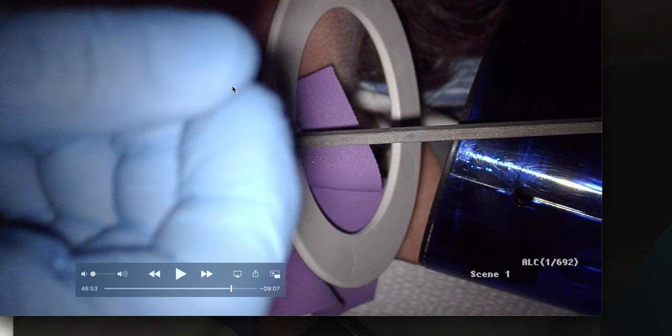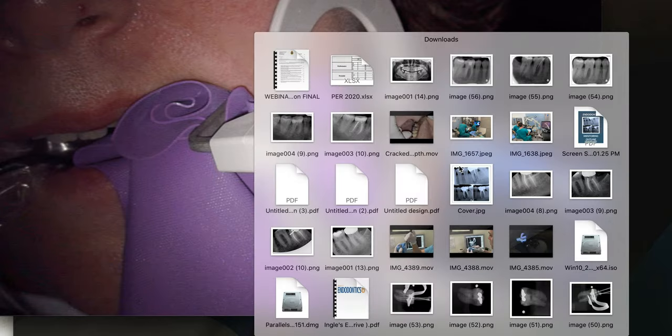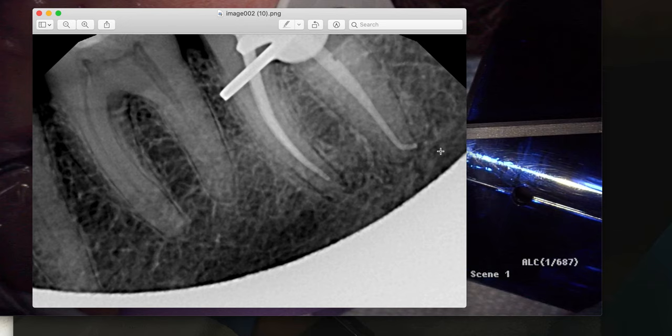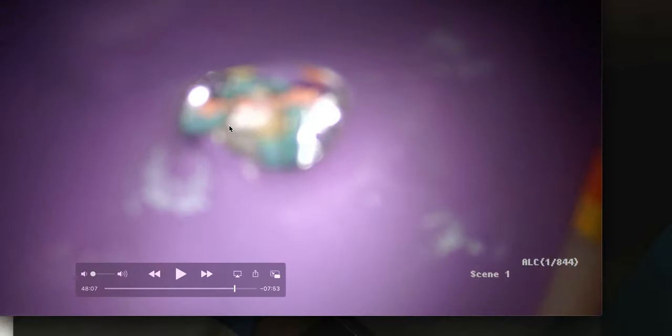I'm using a regular periapical radiograph holder, but I come a little lower and a little more distal to get this radiograph. It's a bit of a cone cut, but rather than having the patient hold the sensor — which moves too much — I use the periapical holder angled this way to get this image.